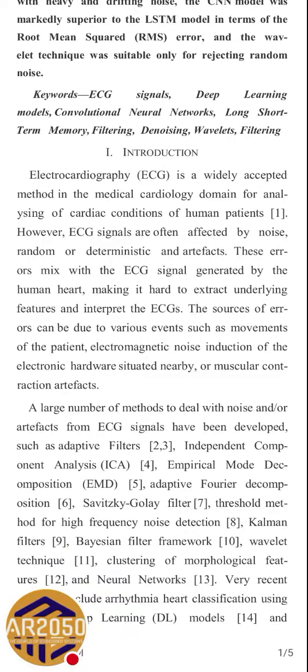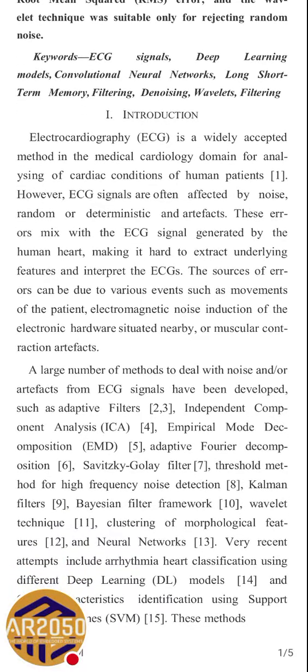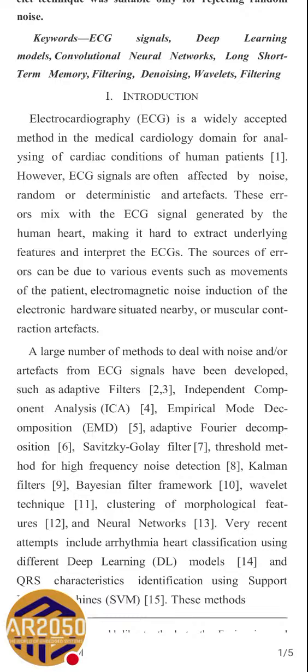It says that ECG signals are often affected by noise, random or deterministic, and artifacts.